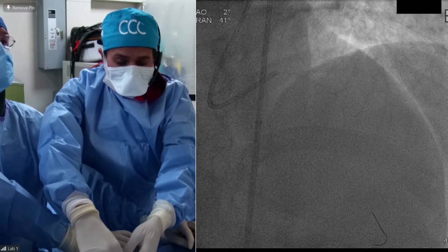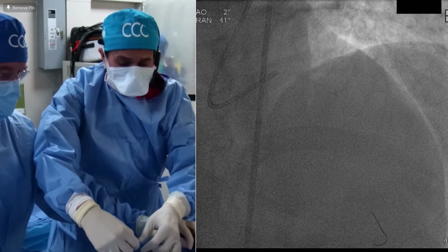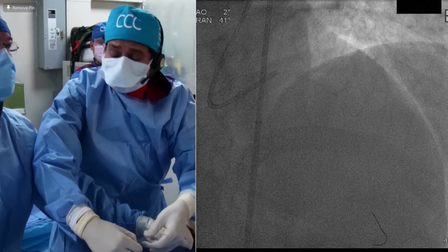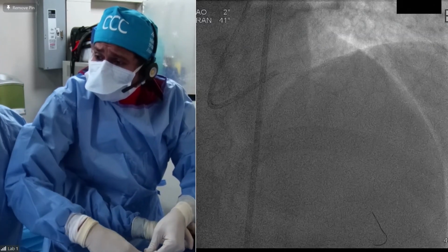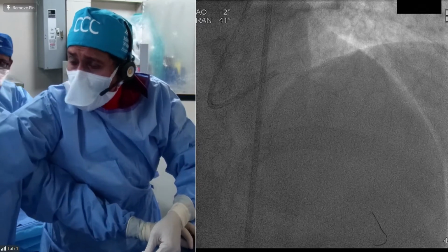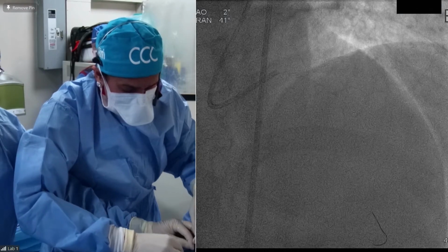Let's start with John LaSala. Yeah, I started to make that discrimination early on about what I do with rotablator and what I do with orbital. This is a better one for orbital. It's not like this heavily calcified super 98% lesion that has a great deal of length to it. And there's no angulation. It's kind of a straight shot, right? Because I worry about the angulations with orbital. Does anyone else have those concerns or no? I worry about angulation with any one of them. Any of them, yeah, of course.